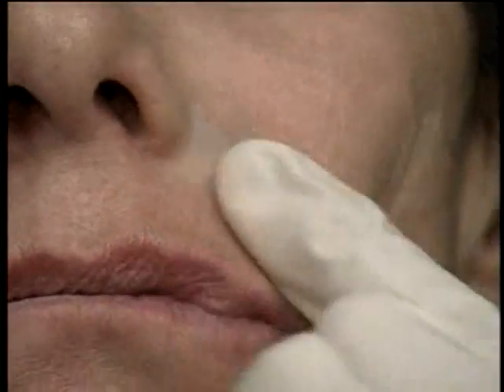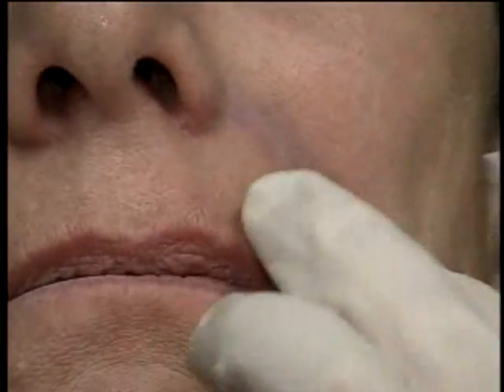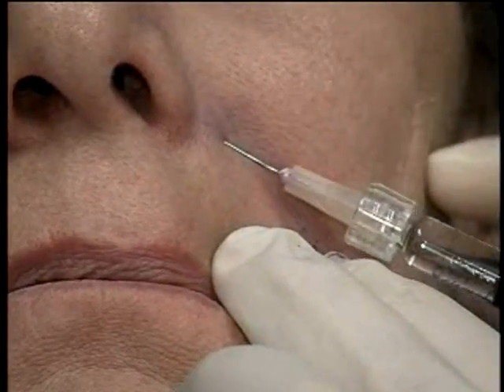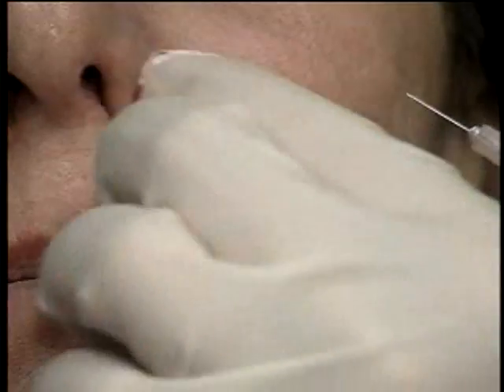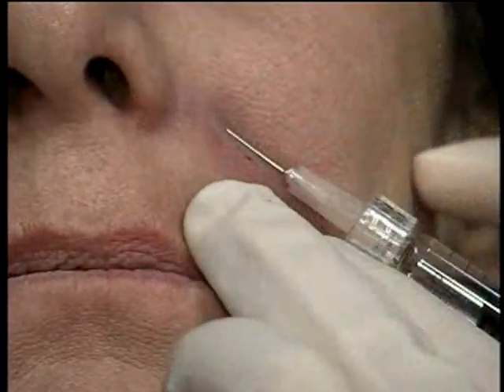Afterwards, you can massage it to make sure that it's in the right place. Coming deep in here, moving slow and purposefully.